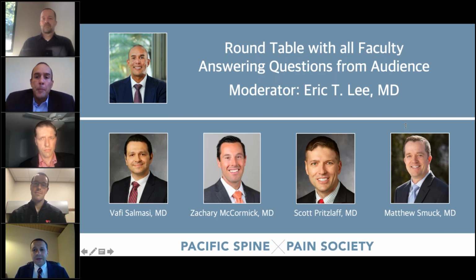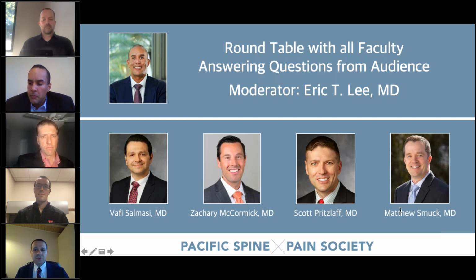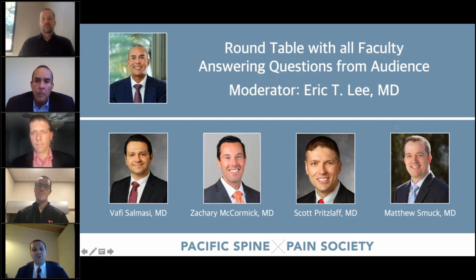So certainly, first of all, I'll answer the easier one. That study was done by Dr. Cheng, and as mentioned, there is also one by Dr. McCormick. There is no specific pattern for where the lateral branches are, so they are really unpredictable. So basically, you want to burn a complete line between the sacral foramen and the sacroiliac joint to try to cover those lateral branches as much as possible. That specific module was built for that study. To be honest, I don't know if it is commercially available, but as long as you can reproduce that by placing your needles appropriately spaced, you can certainly reproduce the results of that study.